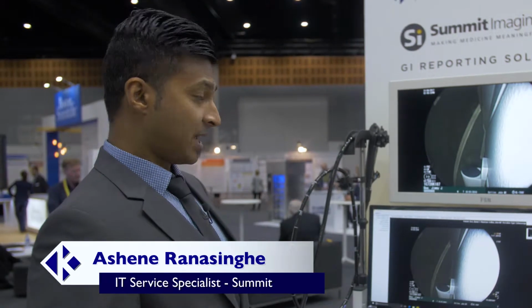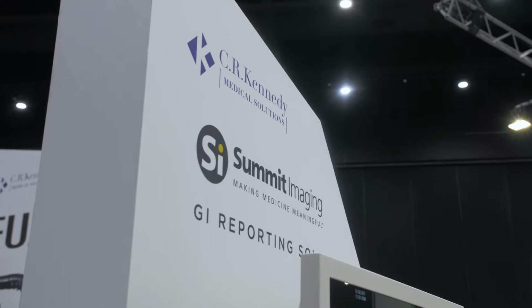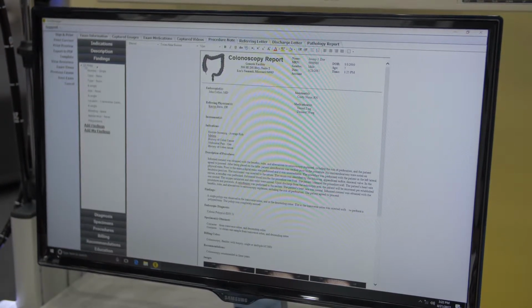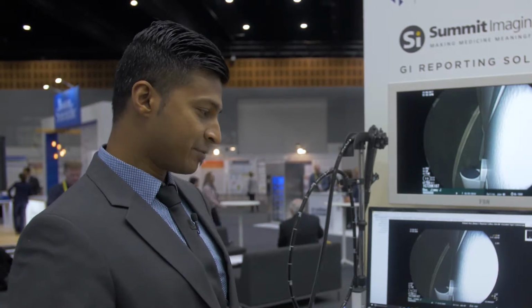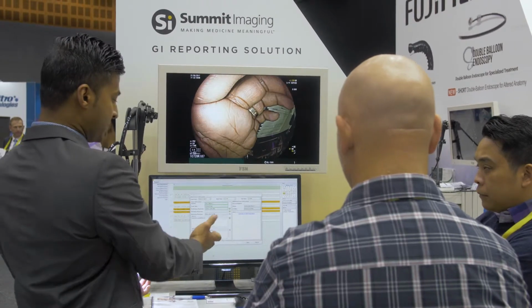SummitImaging is run by a US-based company. We've got a software called Endo Manager, which is basically a reporting system the doctors use for their procedures. It's a detailed reporting system. The pictures the doctors capture come across to this PC we've got. It's a standalone or a network integrated system, whichever way you decide to go with.